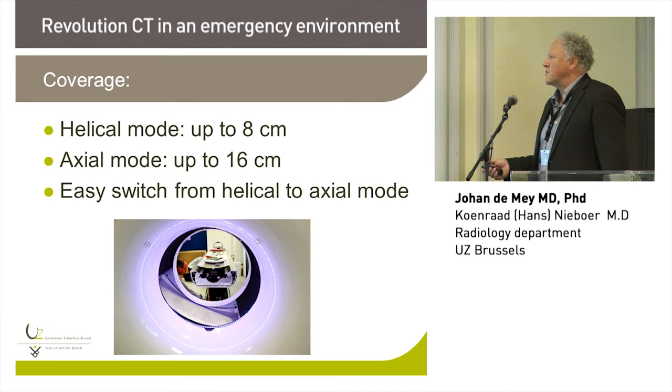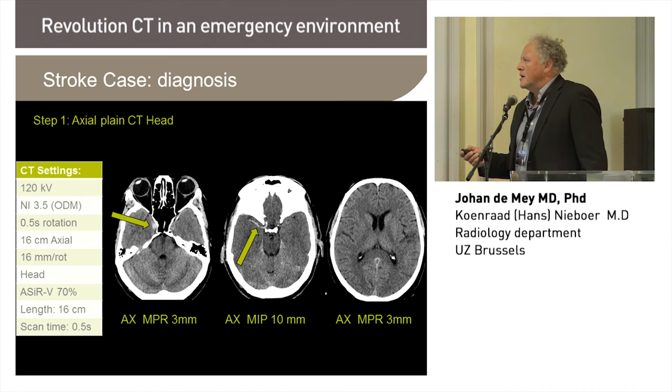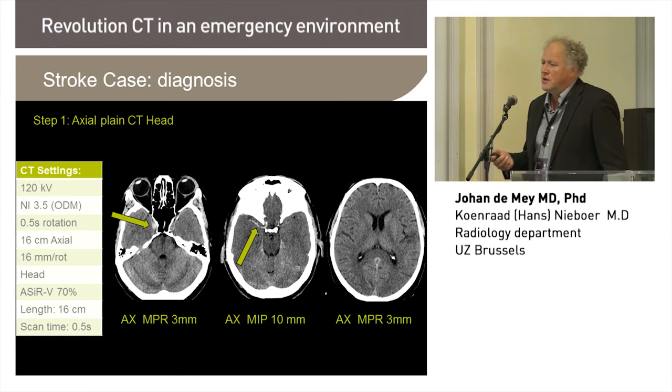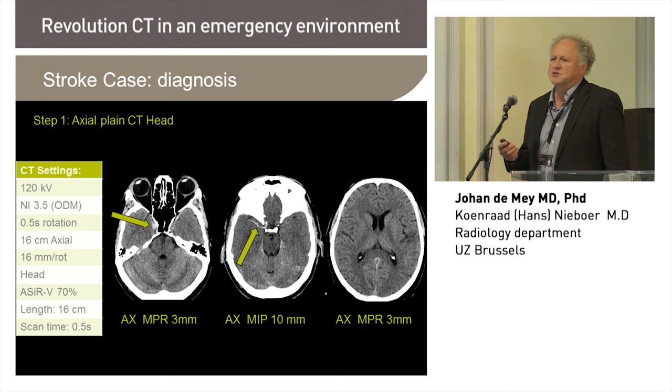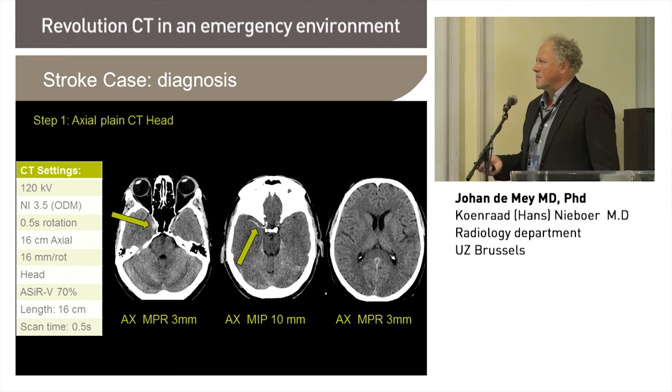And what's important for me is the easy switch from helical to axial. I think this brings something new, which makes different kinds of protocols possible. And I would like to show this for stroke. So we are a stroke center, and we get 3 to 4 stroke patients a day coming in, and they all get an axial plane CT.